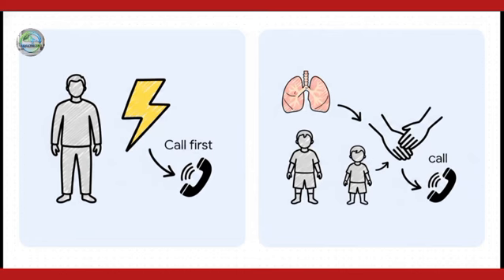So answering that opening question, it all comes down to the baseline versus exception rule. When an adult goes into cardiac arrest, it's almost always an electrical issue with the heart. Because of that, they need an AED immediately, meaning your very first step is to call 911 to get that machine on the way. But an unwitnessed child or infant arrest, that's the exception.